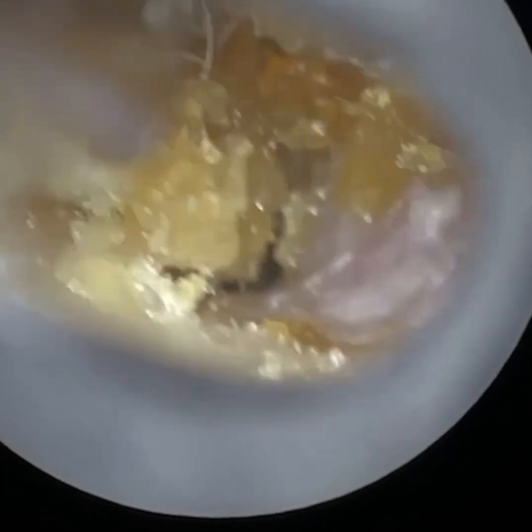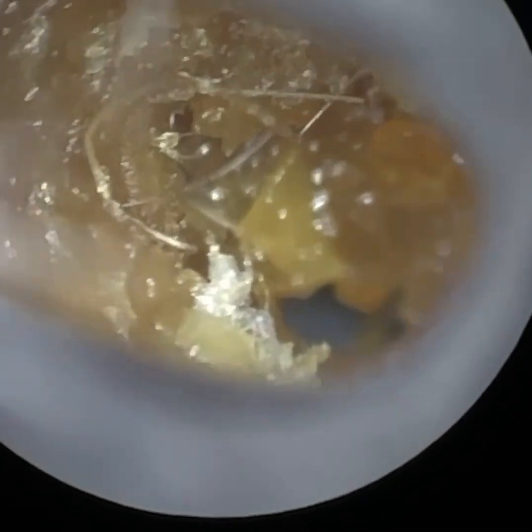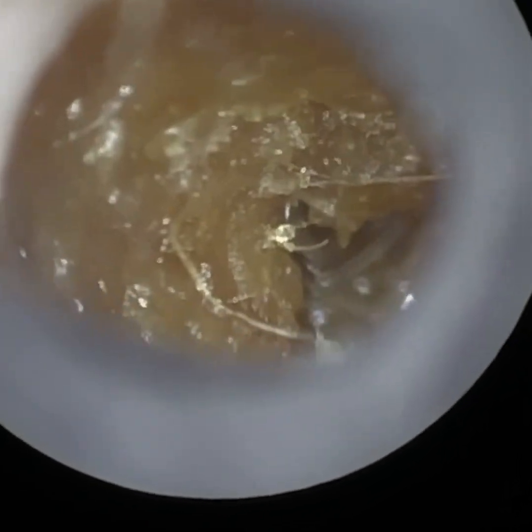If truth be told, nothing can compete with an endoscope, and I've got to be frank about that. The main reason for that is the field of view — it's just incomparable, it's unparalleled in terms of the visuals and the optics.